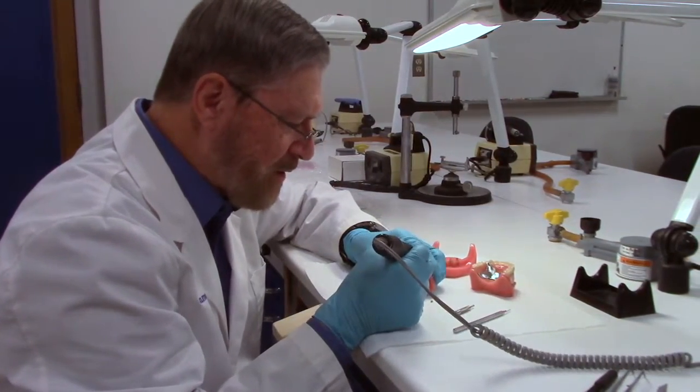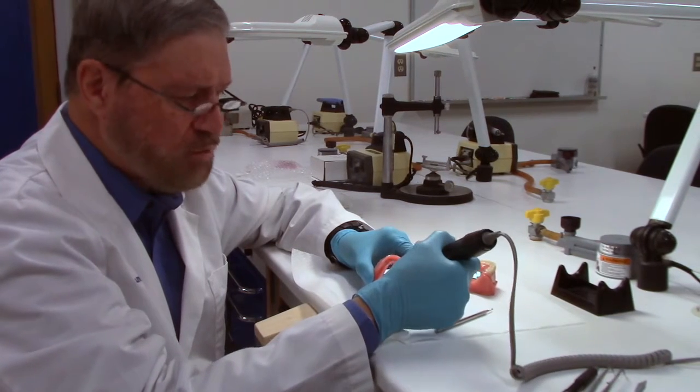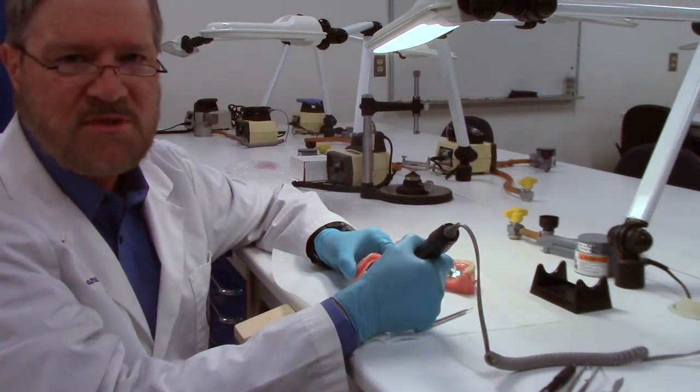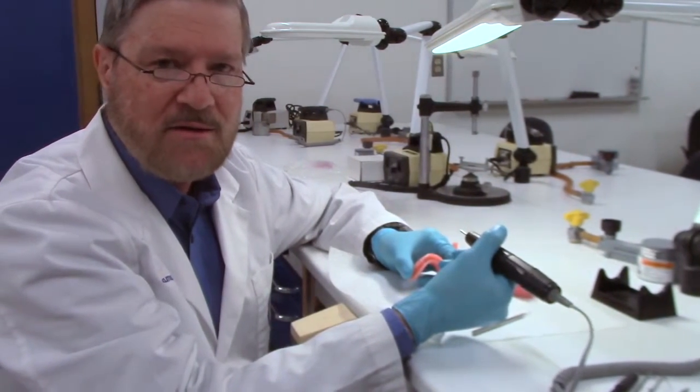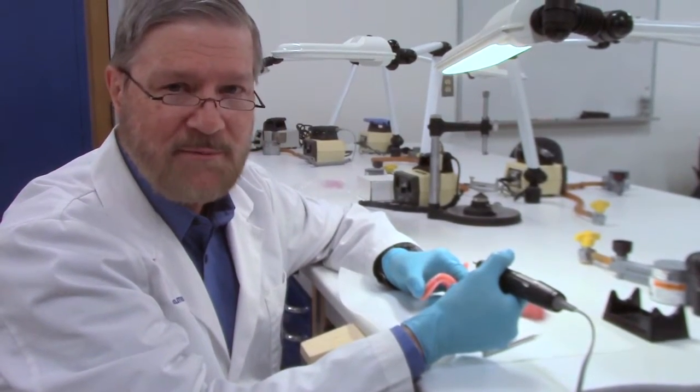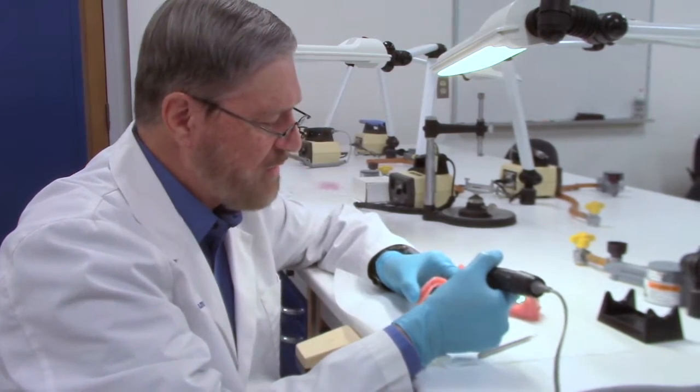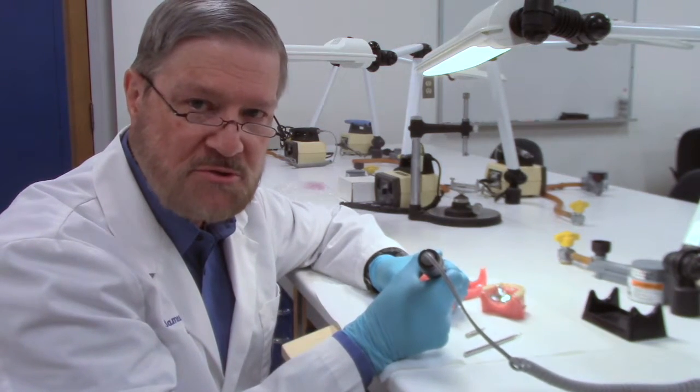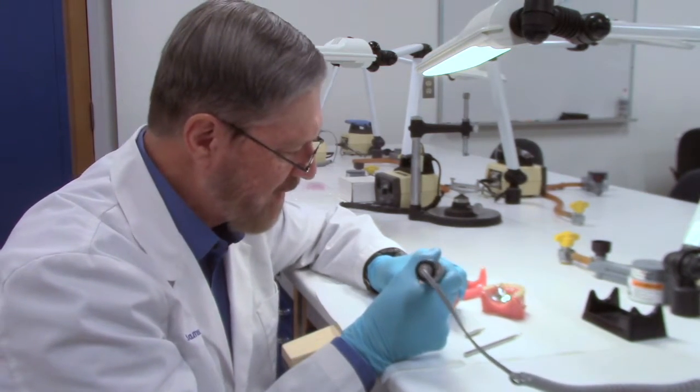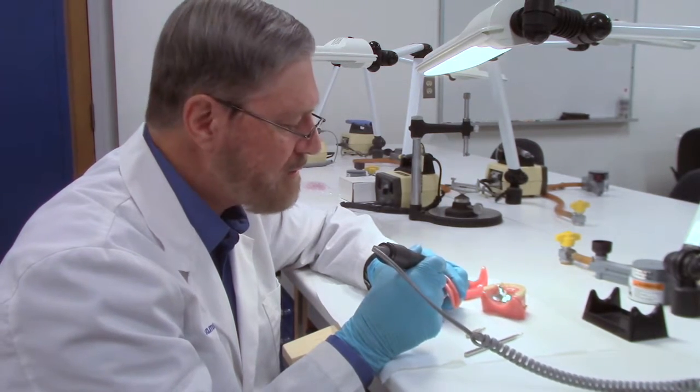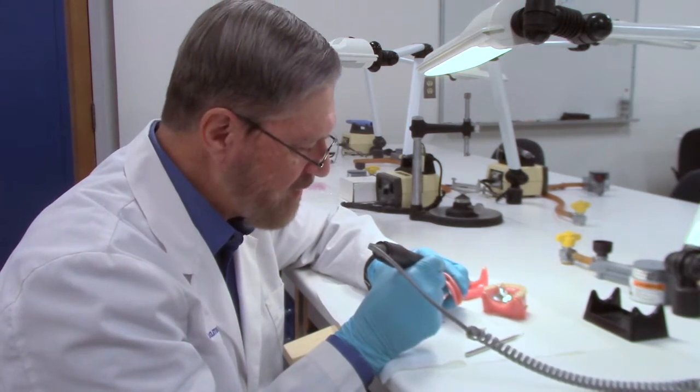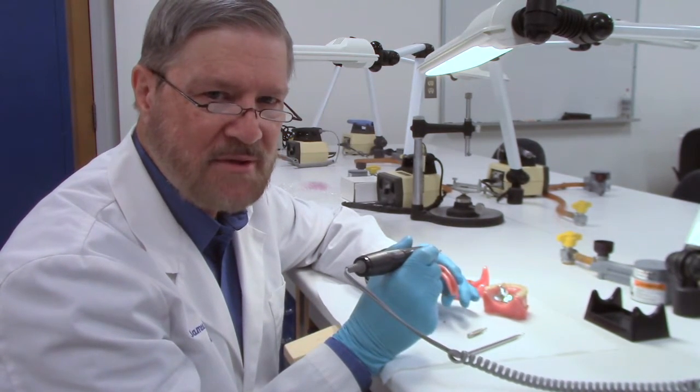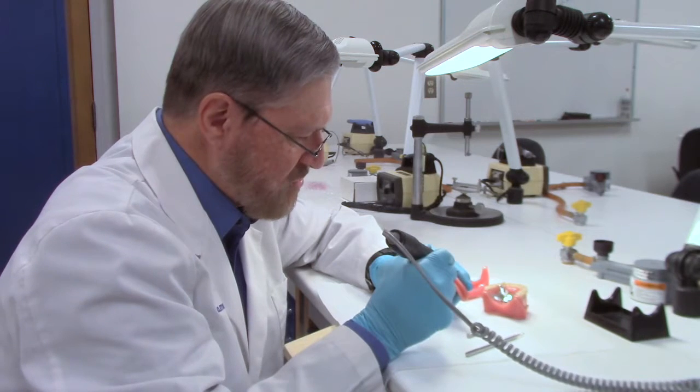But what you're going to do is run this at about medium speed, not too slow, not too fast. And what I'm going to be using is a push-pull cutting action. If you thrust in three times, even if the little button does not stay in the end of your tool, you will have damaged it enough so that you can easily flip it out. But the idea is we're coring through the occlusal aspect of the nylon. And in fact, if you listen, when I hit the metal housing, it kind of gives a little more of a screech.